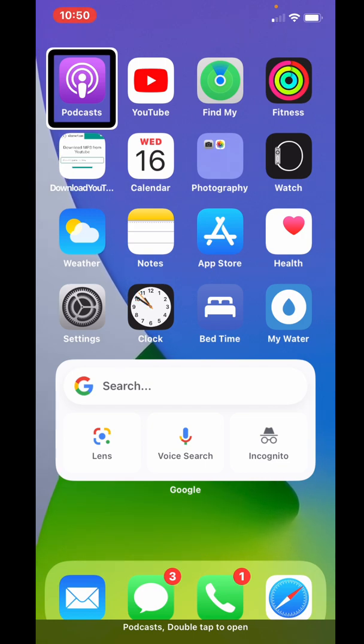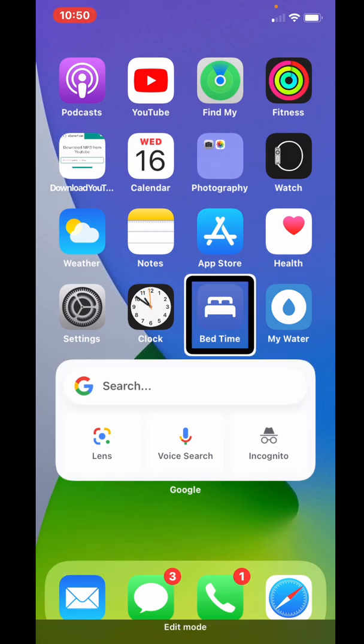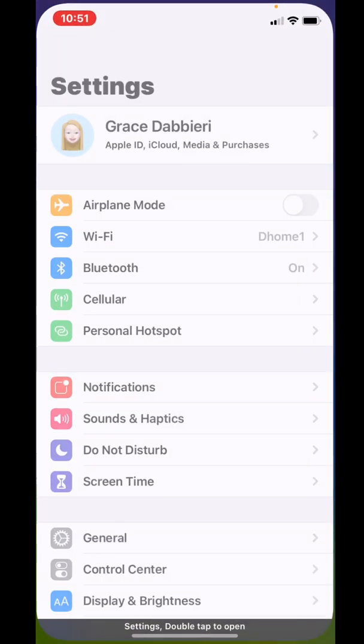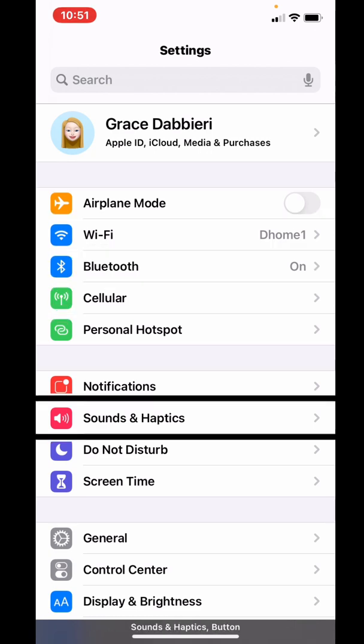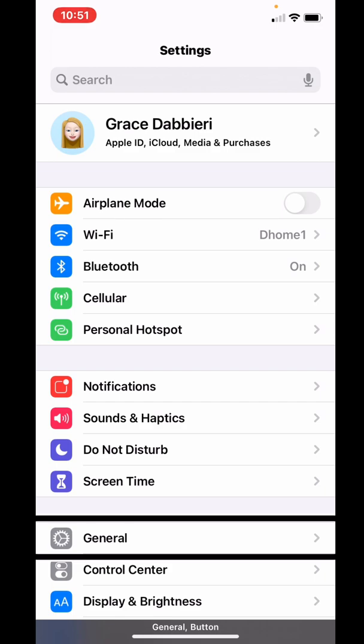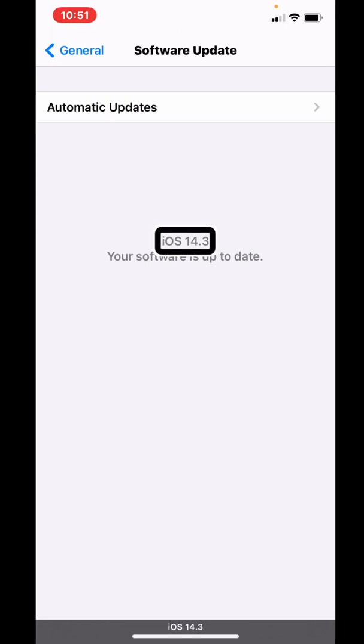The first thing you want to do is go into your Settings, then double tap on Settings. Click into General, and double tap on that. Then click into Software Update, and you want to make sure your phone says iOS 14.3. If it doesn't, you'll hear something like 'iOS 14.3, Apple Incorporated, Install button' — go ahead and install that, and wait until the update is done.